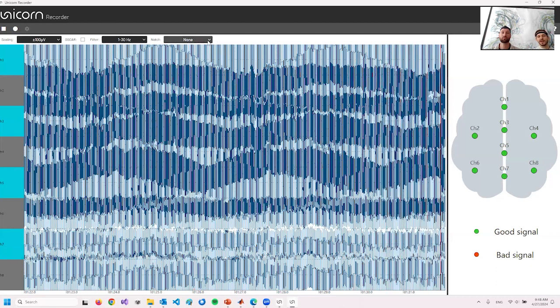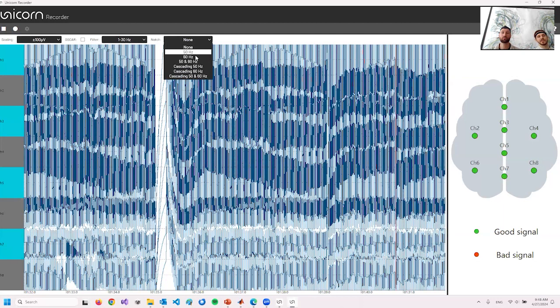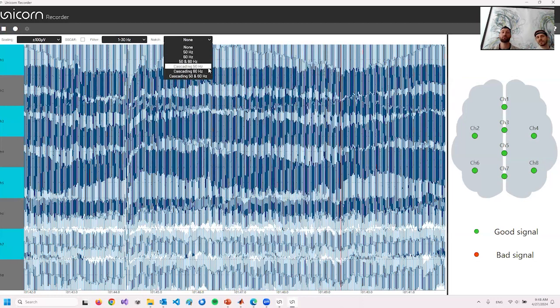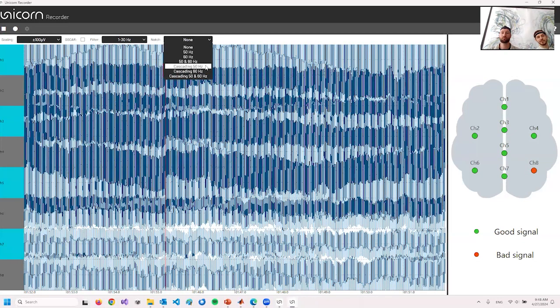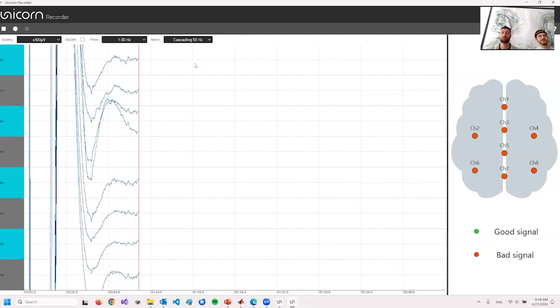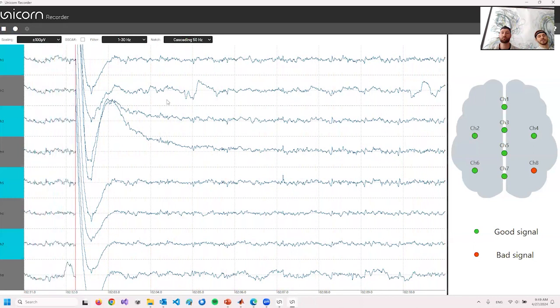To remove the power line hum, we can add another filter, a notch filter. In Europe, we can add a 50 hertz notch filter. In the US, you would use a 60 hertz notch filter. You can also apply both, and we could also apply a cascading notch filter, which is useful for dry applications because you also see multiples of the 50 hertz or 60 hertz in your EEG frequency spectrum. So right now I'm going to add a cascading 50 hertz notch filter, and you can see immediately that the signal looks way more clean, and that's looking like good EEG.